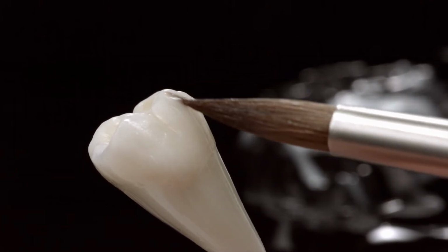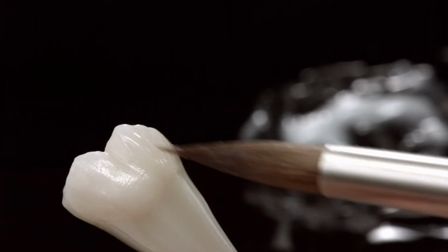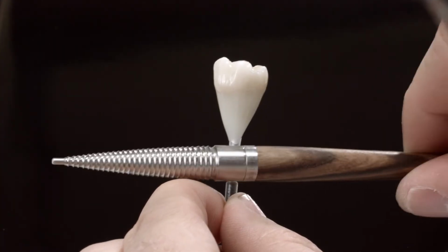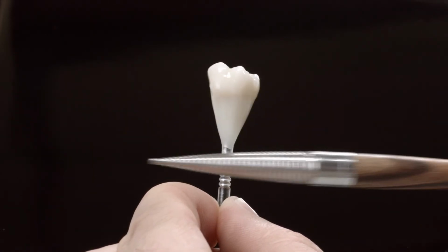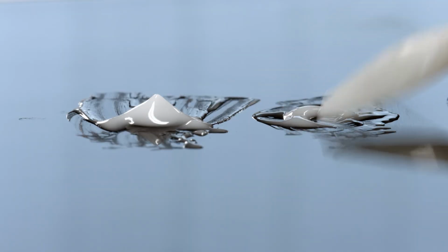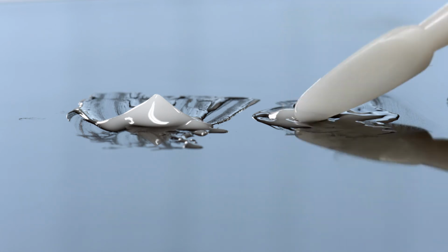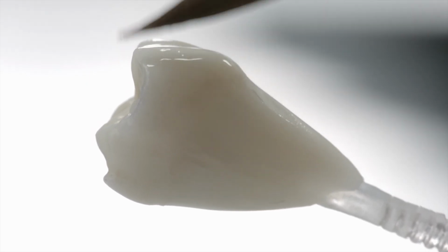The thixotropic behavior of the glaze paste enables the application of superficial textures. If these are not desired, the glaze can be tapped smooth after application. This will create an evenly smooth surface. If you want a less glossy surface, dilute the glaze paste more and apply a thinner layer. Make sure that you do not dilute the mixed consistency any further with a moist brush.